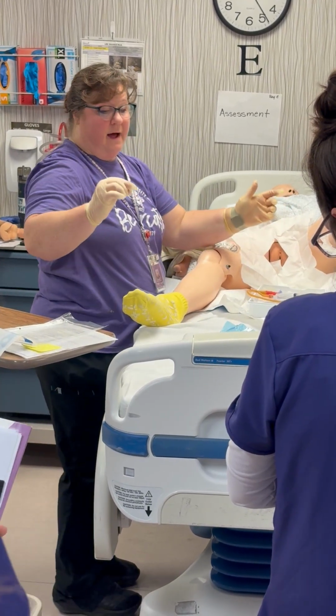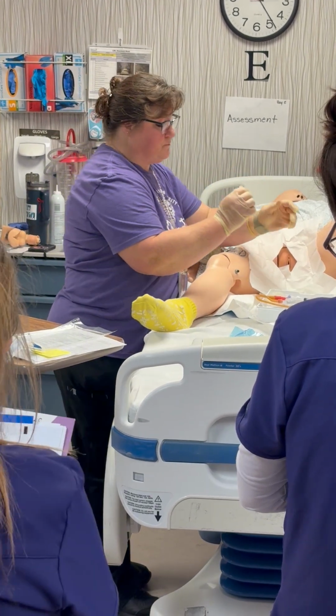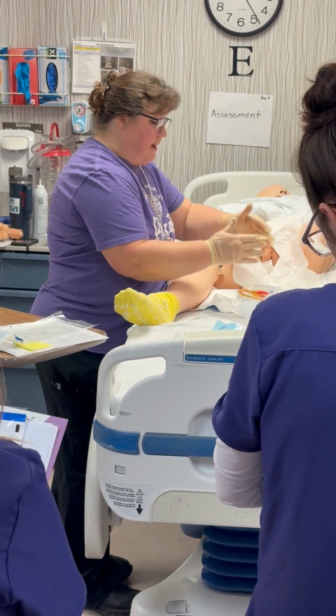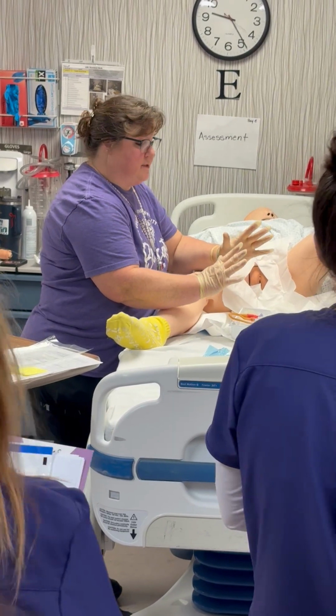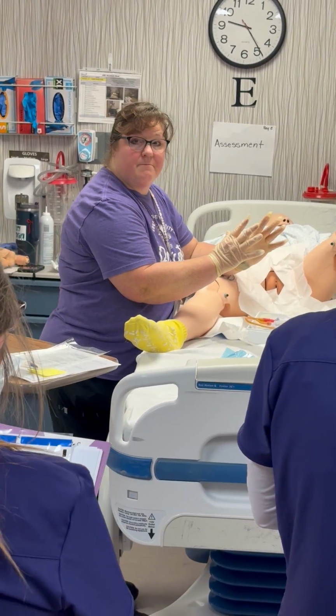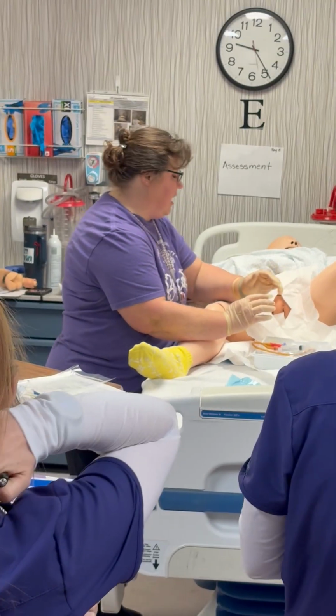And then out and around for anything I have on here, okay? Now I'm ready. I've opened everything up. I've got everything ready, okay? I'm still sterile in both hands, right? Okay, now I have to wash her off.